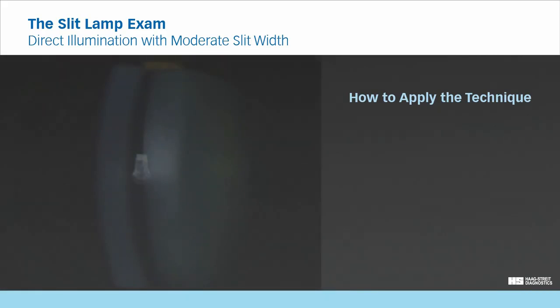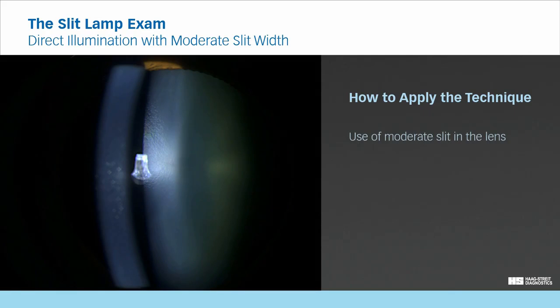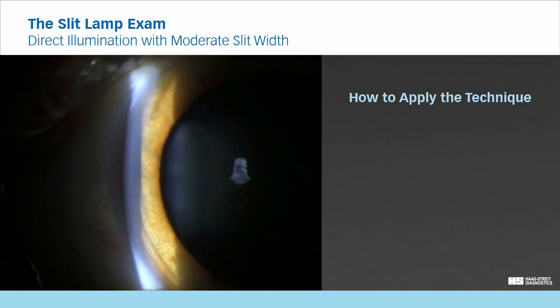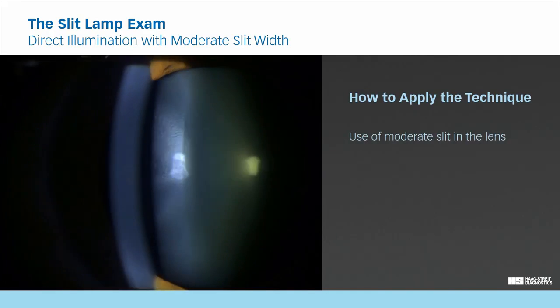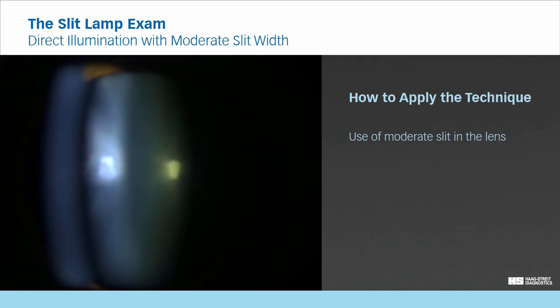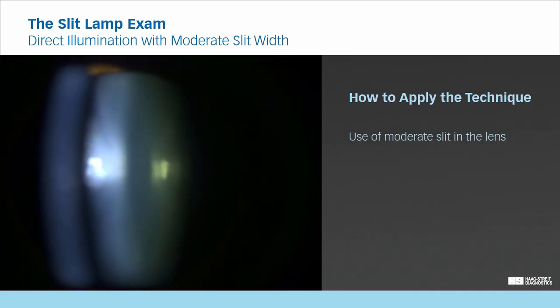When using this technique to examine the crystalline lens, use the iris as a landmark. Once the iris is in focus, move sideways towards the lens and focus on the surface of the lens. You are now able to move the focus toward the patient to observe the depth of the lens.